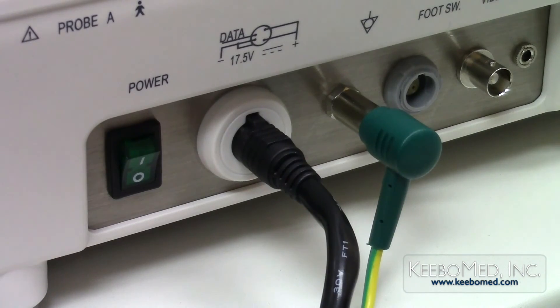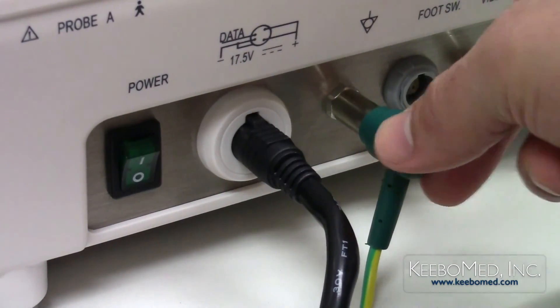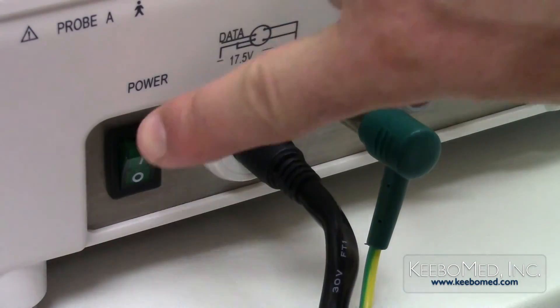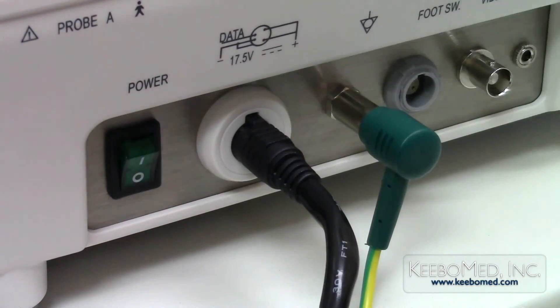Step 6: Double check that all the connections are correct and secure, and press the power button switch to turn the system on. To power the system off, simply press the power button down.